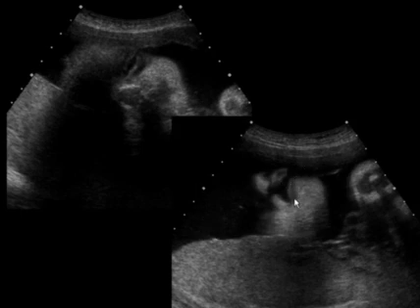You can see the lower lip here and the upper lip, and there's a cleft indeed coming from the right nostril down into the upper portion of the mouth. So to call a face normal, make sure that the soft tissue plane of the upper lip is seen in completion.